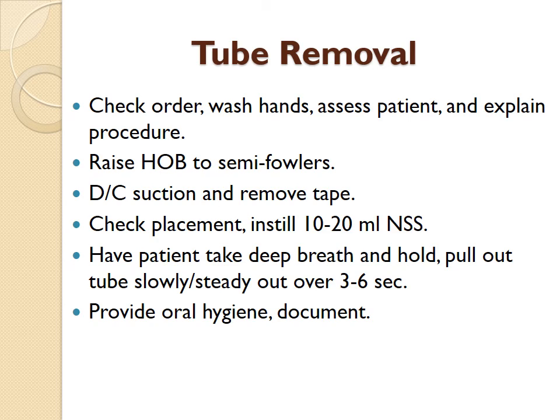And you're going to monitor them. Now, if you're taking this tube out, a lot of times the doctor will suggest prior to tube removal that you, as the nurse, assess their ability to withstand its removal. So sometimes the doctor will tell you to clamp the tube and shut off the suctioning for half an hour or so, to see how they tolerate it. Some facilities, some doctors will say to you, okay, we'll give them one or two of their medications that are able to be crushed and instilled through a tube and see how they tolerate medication in their stomach.